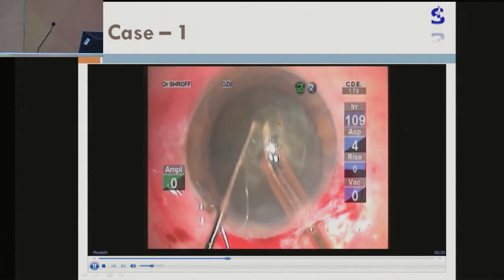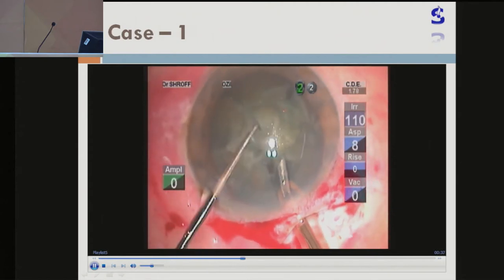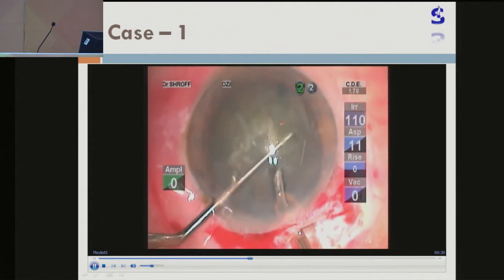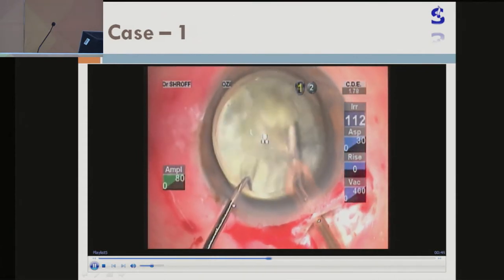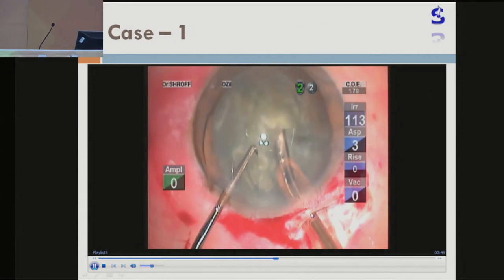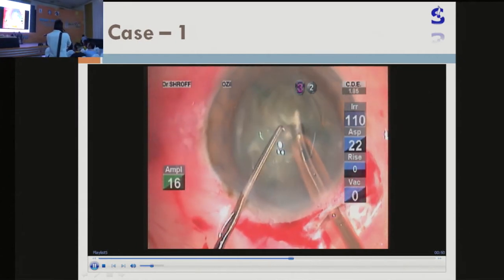It's a very, very good chopper. It's available in three different sizes but I usually use the one millimeter length chopper size. And you can see once the nucleus is engaged — at times it slips, no doubt, but then you can retry. See, it is engaged.